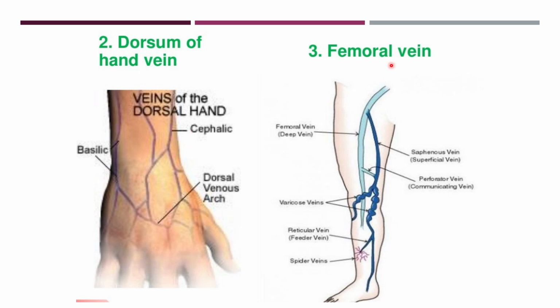This is a very rare condition where you will be taking the blood sample from the femoral vein. The femoral vein is located in the legs. It is a deep and very large vein, meeting here at the top of the leg, where other types of veins can also be found, but this is a very rarely used site.